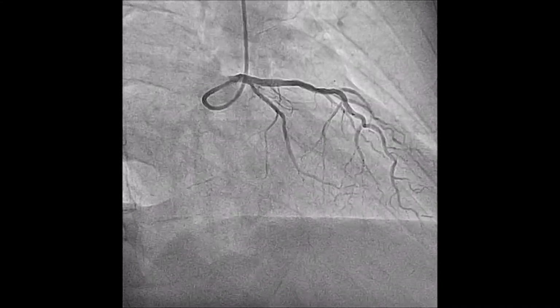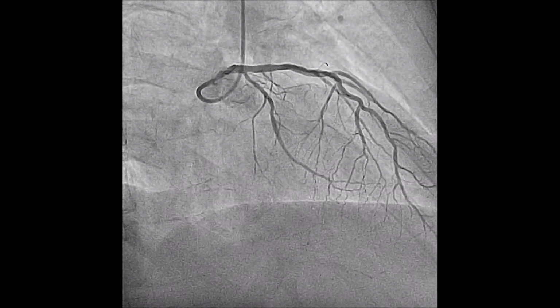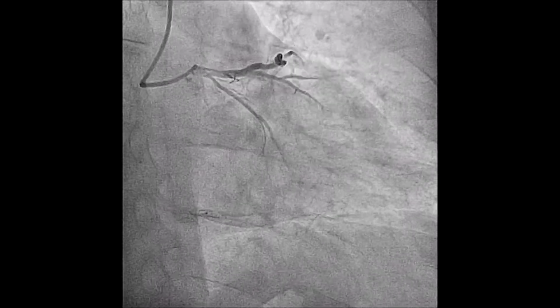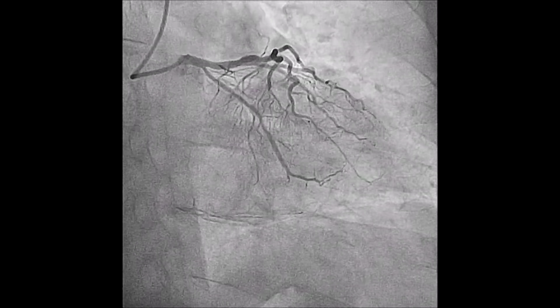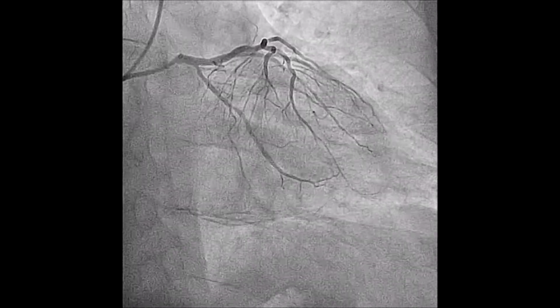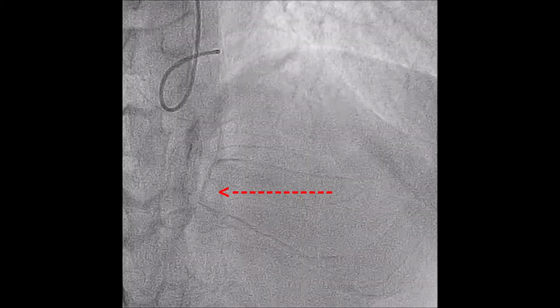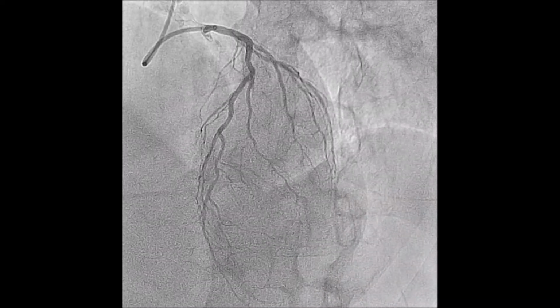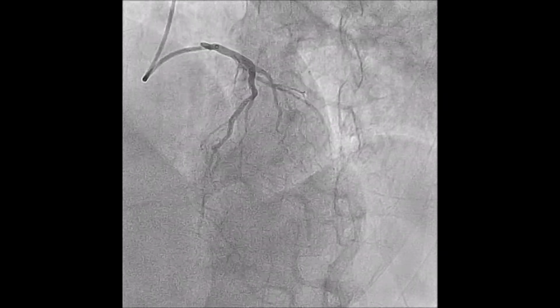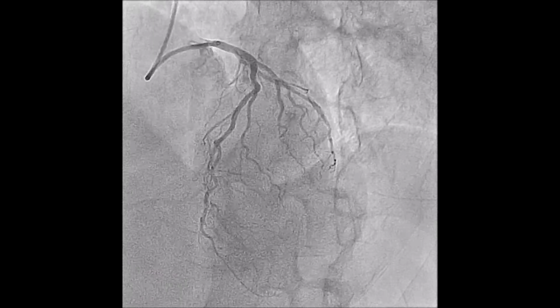As you can see, the left coronary tree has no significant lesions angiographically. However, left coronarography shows an interesting finding. Can you see it? That's it. It is the right coronary artery whose distal bed is visible thanks to the existence of heterocoronary collateral circulation. This suggests that the right coronary artery is probably closed, which would explain the ST segment elevation on inferior leads of the electrocardiogram. Let's take a look.